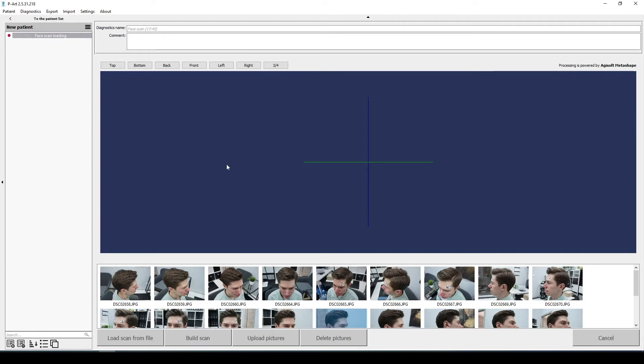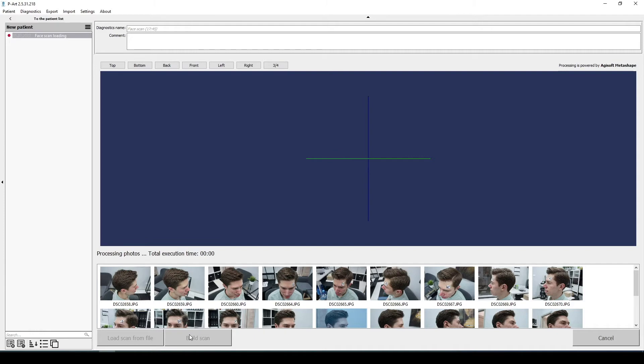If photos are marked green color, then the program will make a good scan. All parameters are correct and you can start building a face scan.